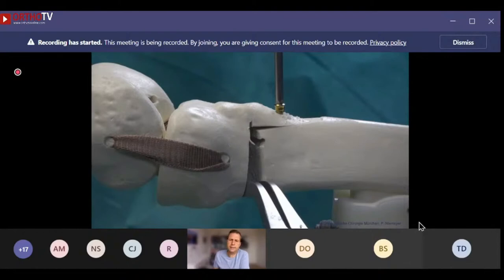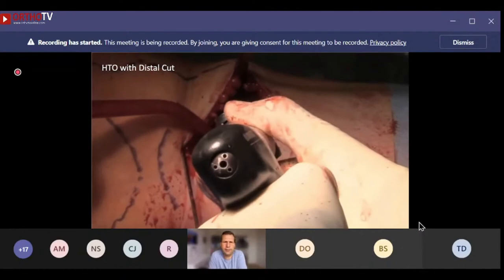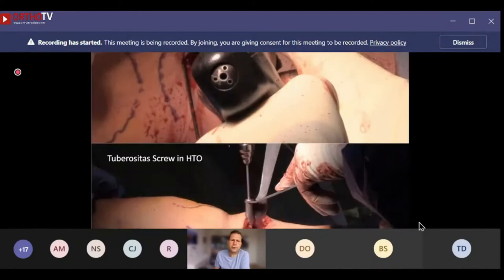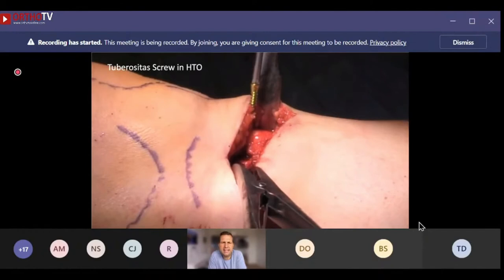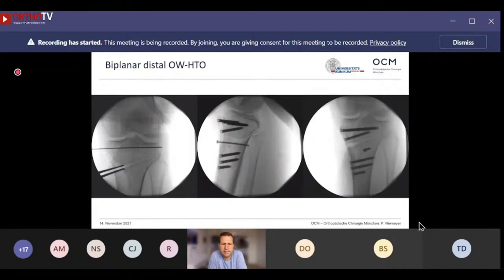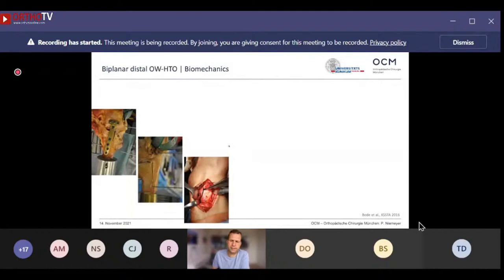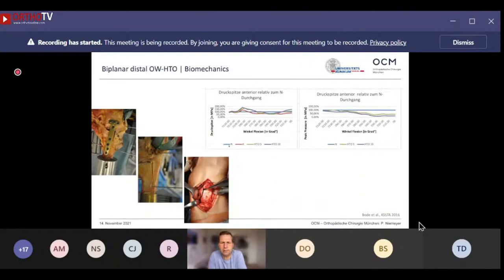In this modification, soft tissue protection anteriorly is critical while the tuberosity is left in place. Since this modification results in higher instability, we use a lag screw to refixate the tuberosity. The postoperative radiograph shows the open wedge osteotomy using the Atrex Power Peak Plate, which allows nice visualization of consolidation, along with the additional lag screw for tuberosity refixation.